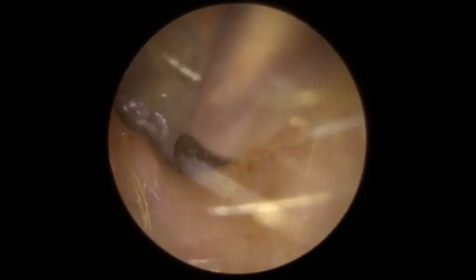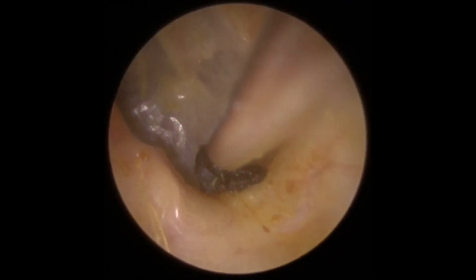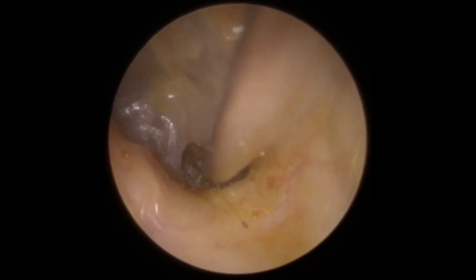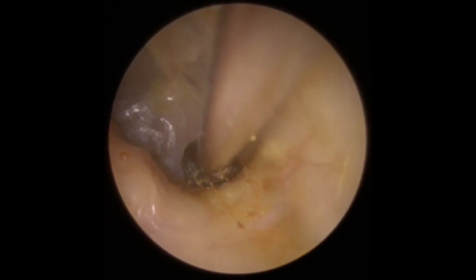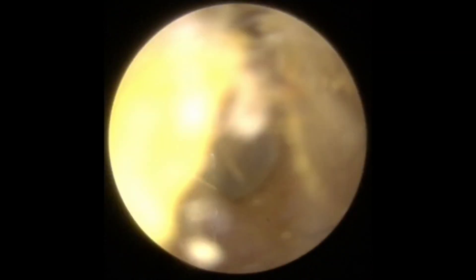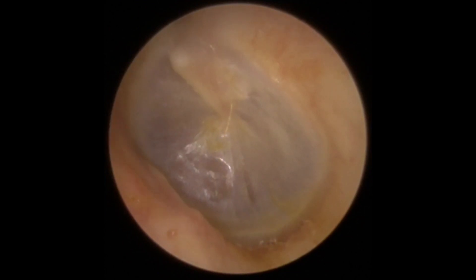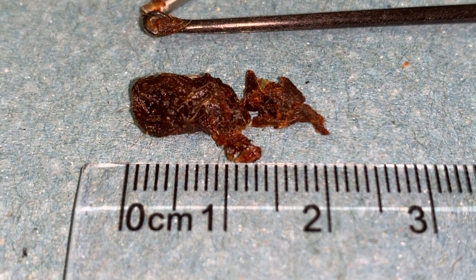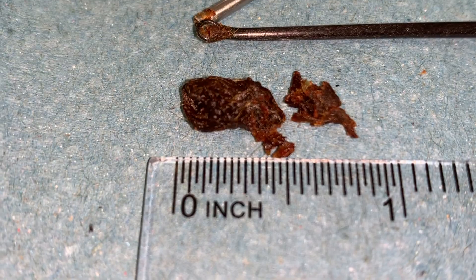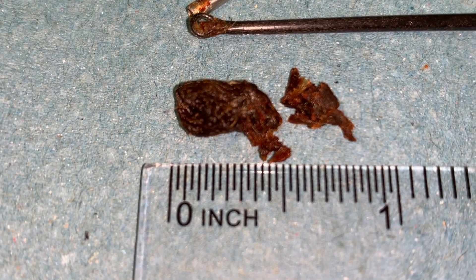One tiny bit remaining. Looking at the eardrum, can you see that the skin isn't flat? It's very wrinkled. The eardrum is a little bit what they call flaccid, which basically means it's very wobbly — there's a lot of movement to the eardrum, very loose skin rather than being pulled really taut, which happens in some people. And this is what we removed: that reddish-brown, darker-coloured wax there, using the Jobson Horn and the standard size Zolna tube.